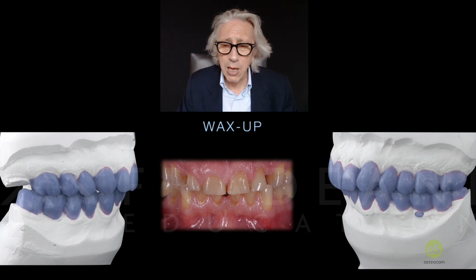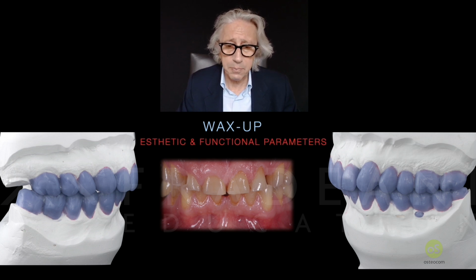That will be my goal, to copy the wax-up that we have done. Of course, if the wax-up, once it is printed in the patient's mouth, becoming the mock-up, is really following all the instructions, all the characteristics, the features that we believe should be created in this case.